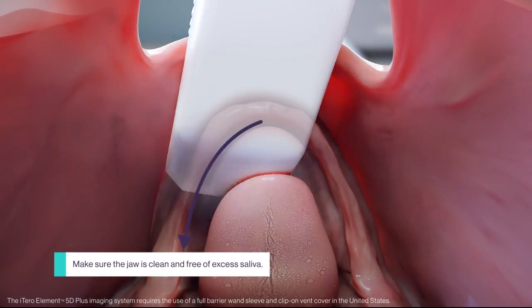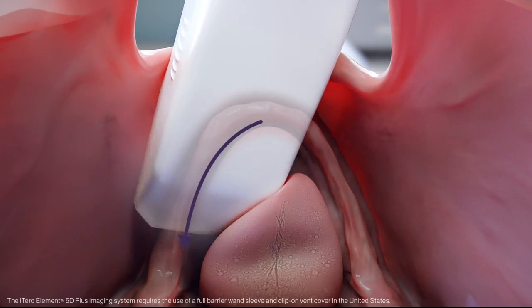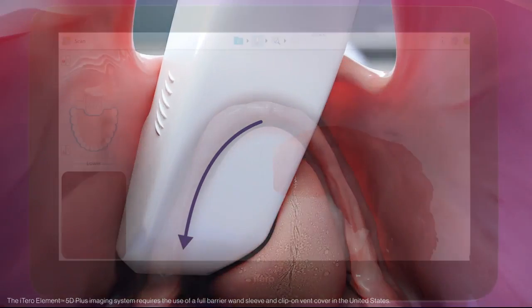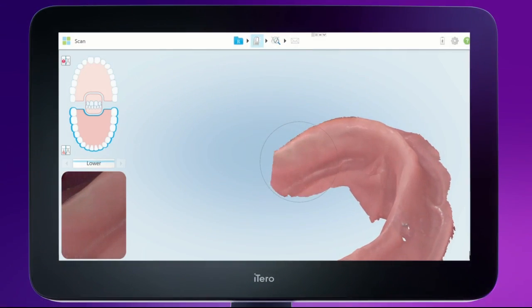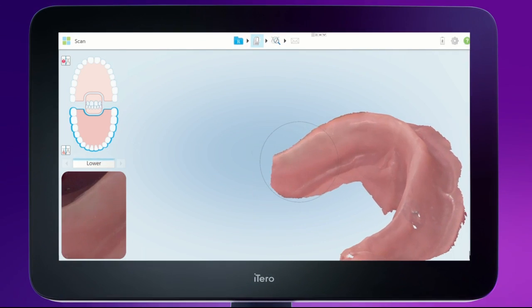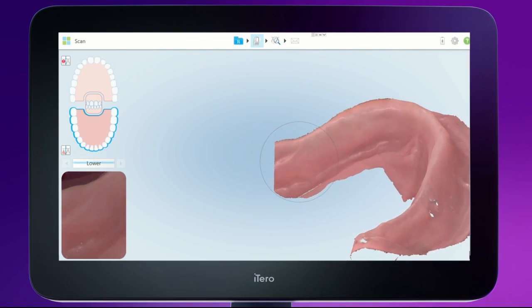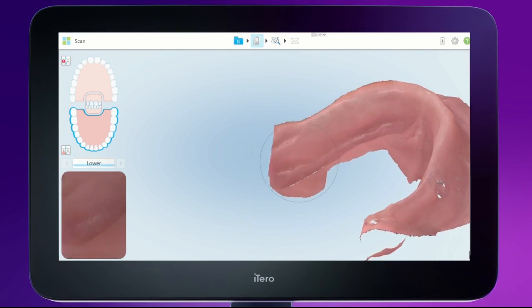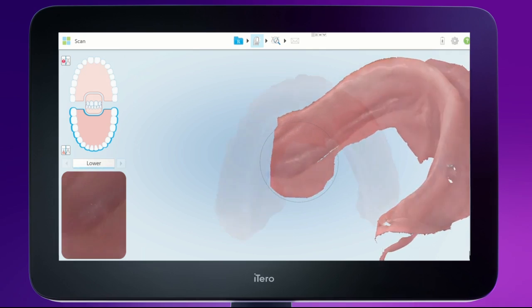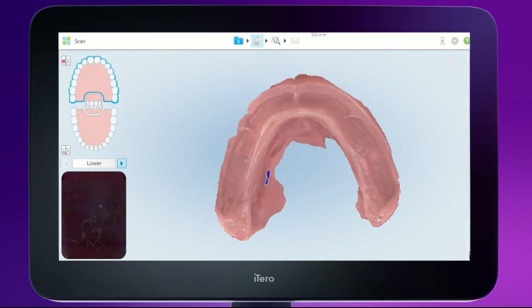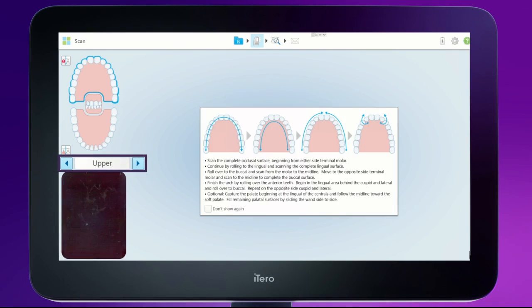Repeat the process on the contralateral side. Areas that require scanning to capture missing anatomy are highlighted in blue. Tap the arrow segment to switch to the upper jaw.